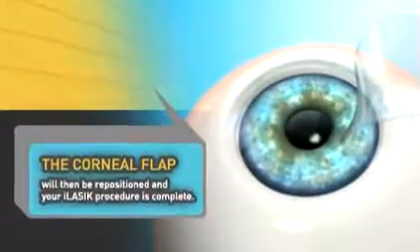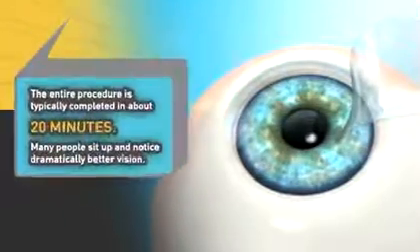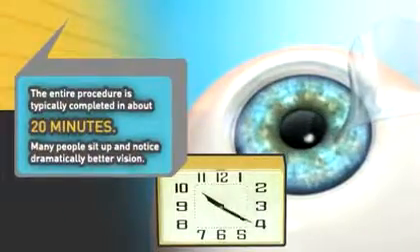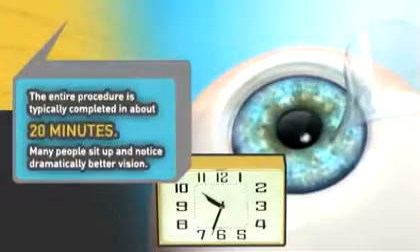The corneal flap will then be repositioned and your iLASIK procedure is complete. The entire procedure is typically completed in about 20 minutes. Many people sit up and notice dramatically better vision.